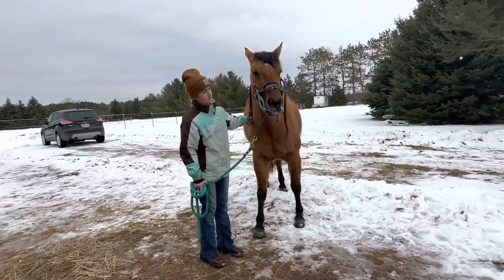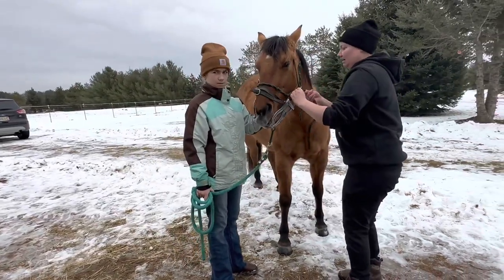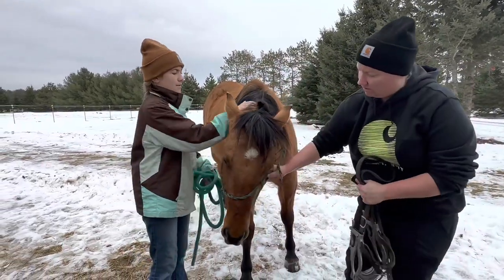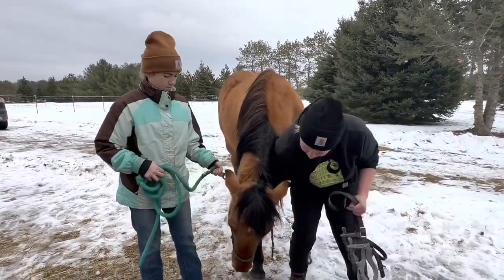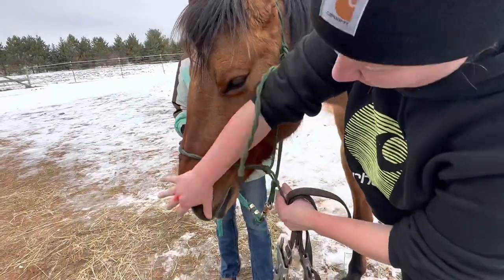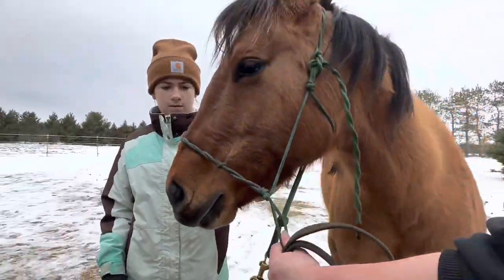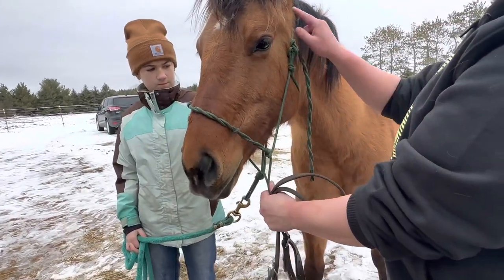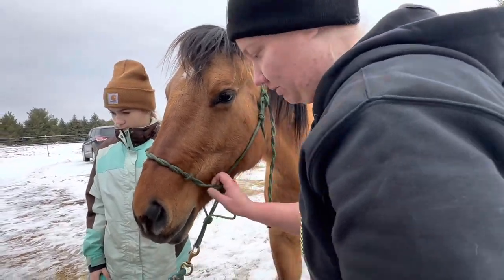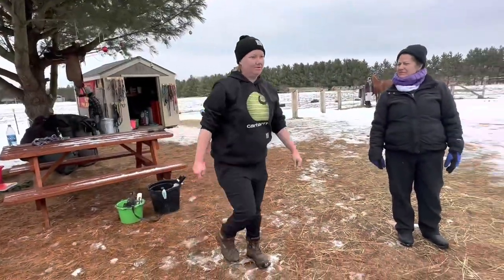Now, I'm taught something that's called a three-point balance. And what that is, girl, is it's a balance between her TMJ, which is her jaw joint right here, her molars that are all back in here, and her incisors, the teeth up front. So what that means is we must address the molars and also the incisors to ensure that she's properly balanced all the way across. And I'll show you something here that I noticed last time.